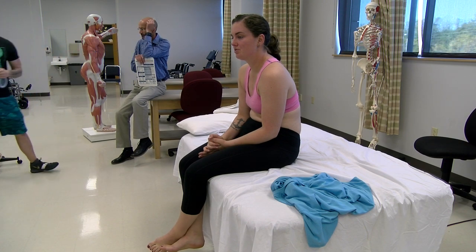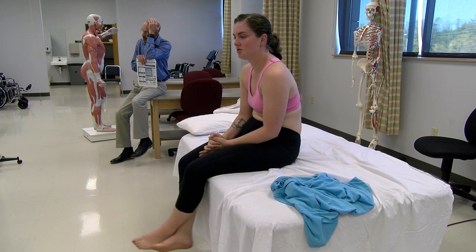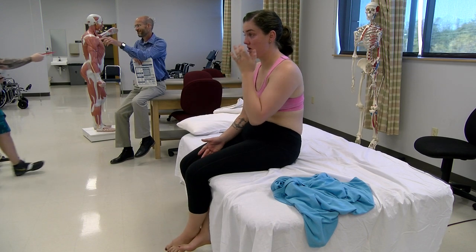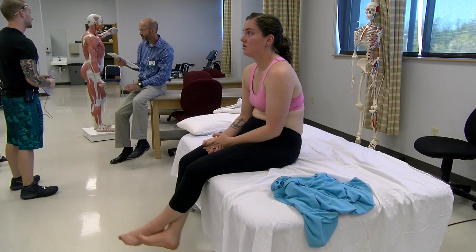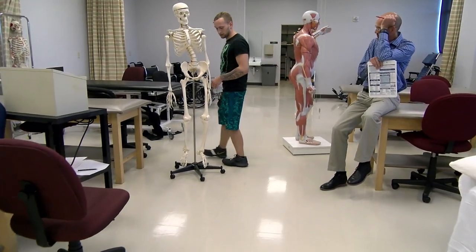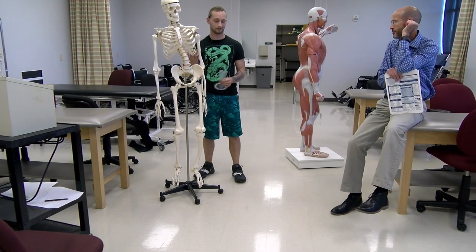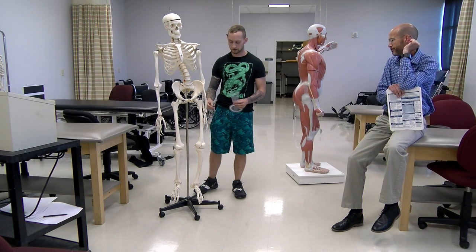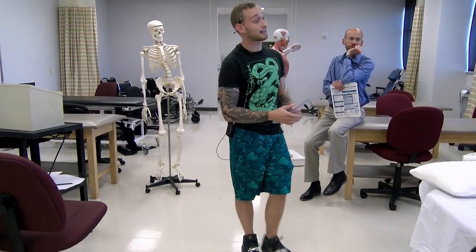So this motion — thank you, sir — squeeze your shoulders together and show that motion. I'm seeing the landmarks on the skeleton: right shoulder, medial rotation. So for the axis, we're going to start off with the olecranon process. For the proximal arm, I'm going to go ahead and choose making it perpendicular to the ceiling. And for the distal arm, I'm going to use the ulnar styloid process.